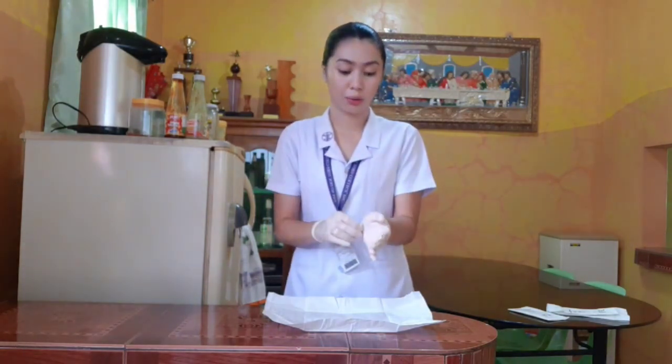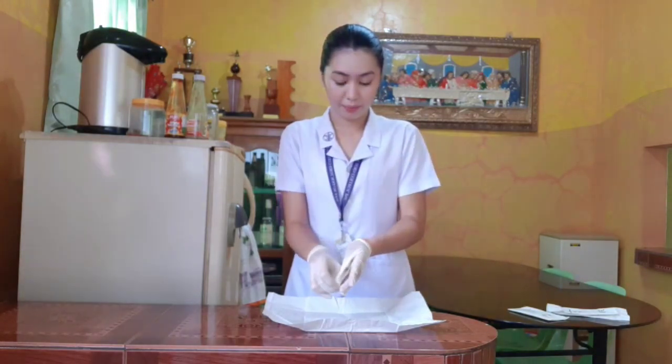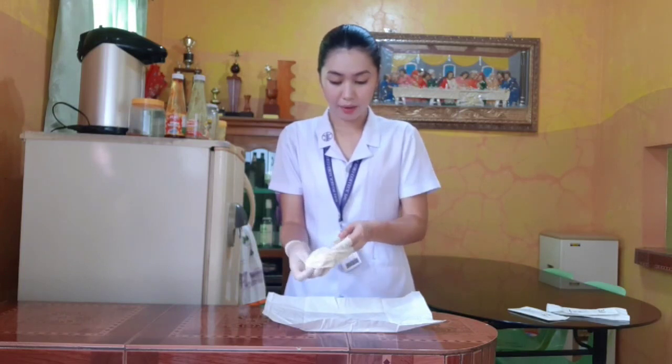Okay, now to remove the gloves, I am going to first remove the glove of my dominant hand by grasping the glove here in the palm area or in the cuff area. So either way can do. Okay, like this. Removing carefully.